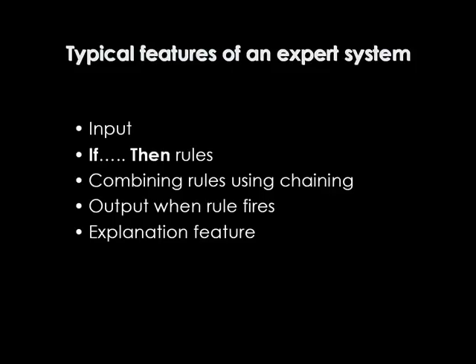The typical features of an expert system include an input, which in our case is input from the physiologic monitors, a series of if-then rules that are applied to these inputs, a process whereby one or more rules can be combined in a process called rule chaining. Once we have one or more rules that fire, this produces an output, and associated with the output is some explanation feature that gives information about why the specific rule has fired.